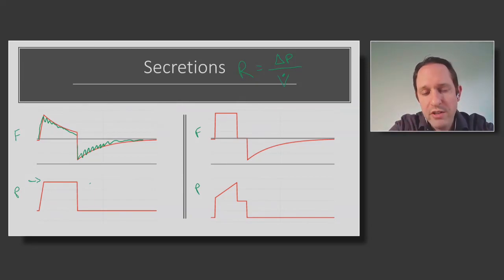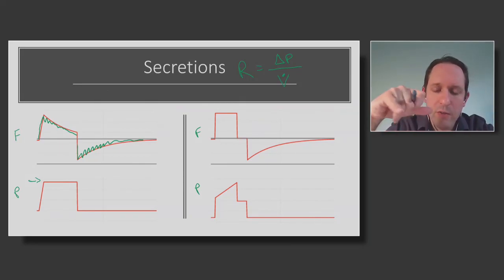And of course, alterations in the expiratory flow can always potentially be patient effort, but usually when it's not that rapid. So troubleshooting this, the first thing you should do is look at your ventilator circuit and the tubing, because the same kind of noise that you see on that flow pattern can also be generated by water in the circuit or in the catheter mount, which is where the inline suction catheters normally sit if you're using them.